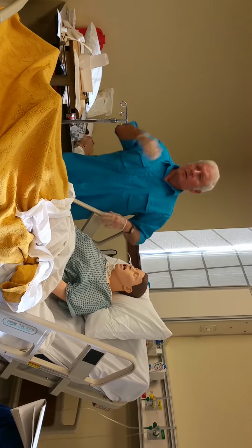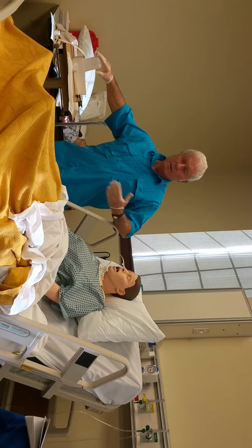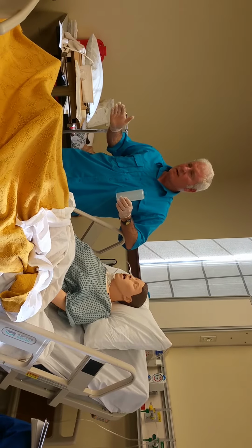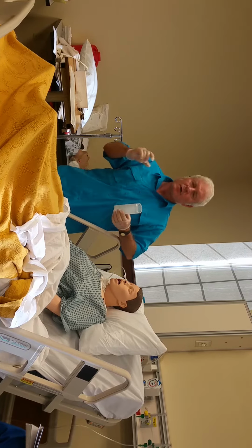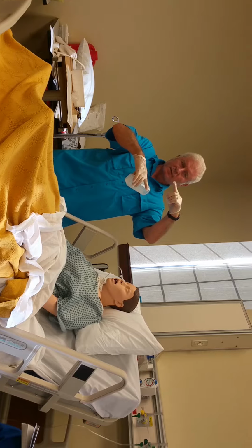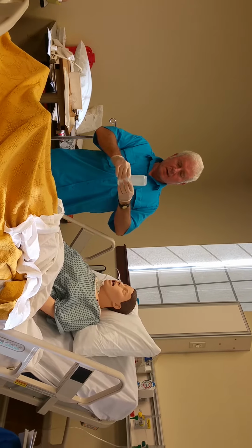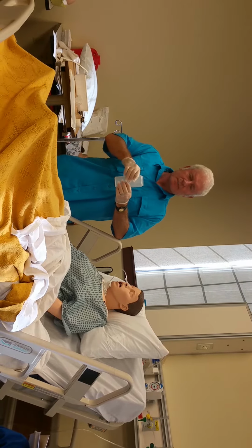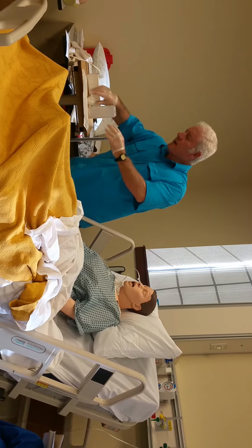Okay? Part of the checkoff is going to be medications or feedings. You do it the same way. You have to pour it in. So let's say we want to give medications. You'll have the little plastic cups that they use for drinking water, like 6 or 8 ounce cups. You crush up one pill at a time, put the powdery stuff in there, pour some water in the cup.